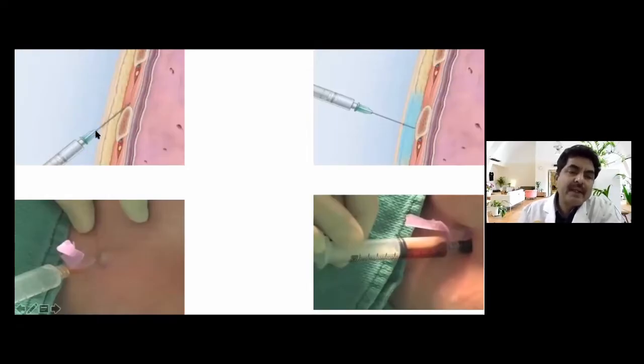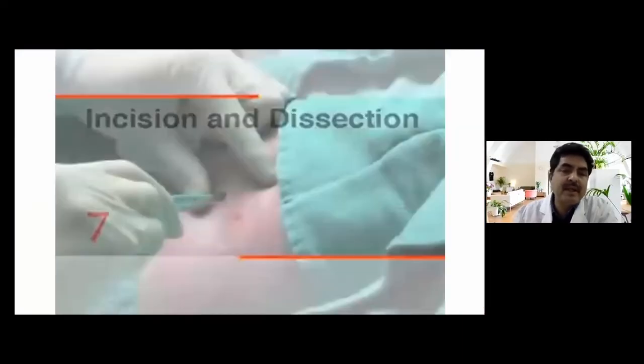So you have to put the needle in an oblique fashion so that you can avoid that. You have to put the needle just above the rib below. You know the costal groove lies in the lower margin of the ribs and contains the intercostal vessel. But in the upper margin, there is nothing. So you can put it over here. Then you make a flare like this. Then you may push the needle within the pleural cavity so that you can aspirate, or you can see what is the content inside, or you may confirm whether you are inside or not. Then you can, of course, infiltrate the local anesthetic into the parietal pleura. Otherwise, the patient will not cooperate with you. He or she will get the pain.